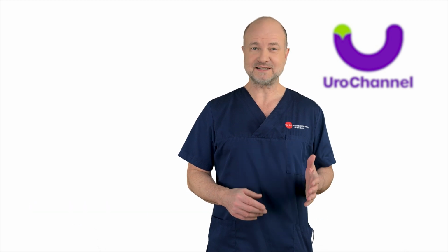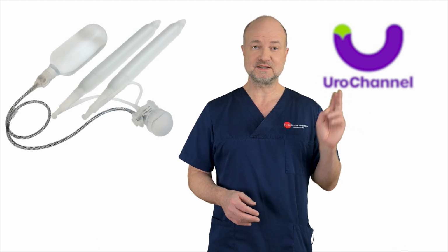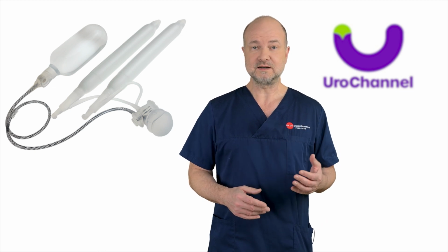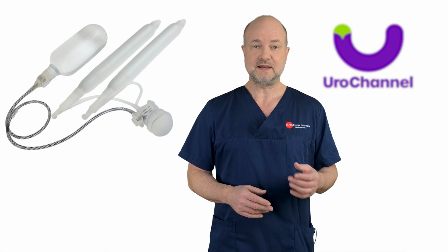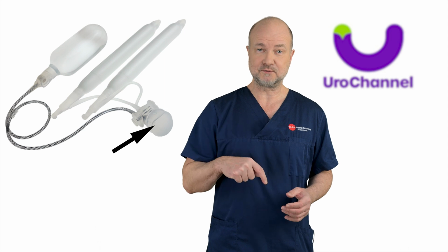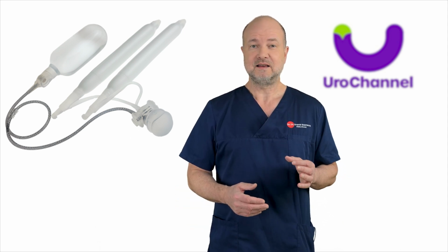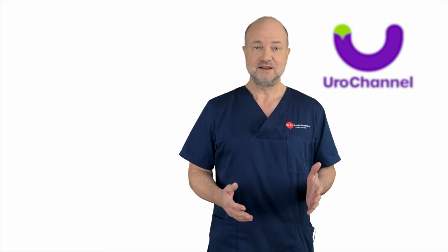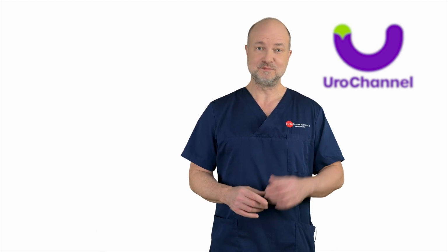So, how does an inflatable prosthesis actually work? It consists of 2 inflatable cylinders. These can be filled up with fluid to mimic an erection. The fluid comes from a reservoir that is anchored inside the body close to the bladder. With a small pump in the scrotum near the testicles, you pump fluid from the reservoir into the cylinders. Attached to the pump, there is a tiny button that you can push to make the fluid flow back into the reservoir. From the outside, you don't see a thing and you can get an erection within seconds. That's the beauty of it.